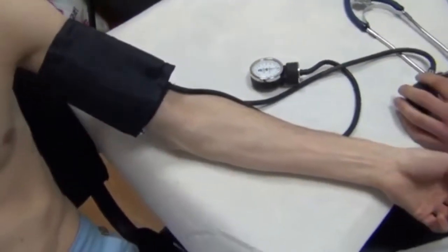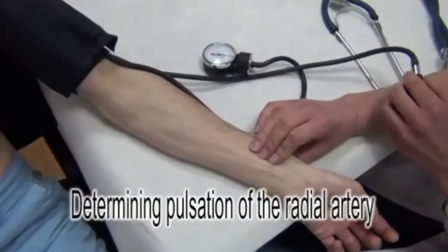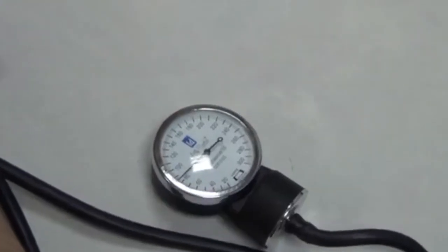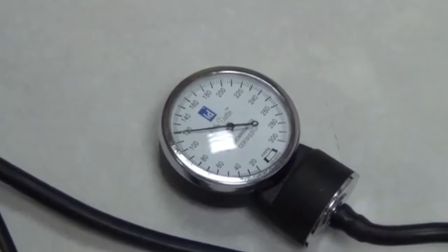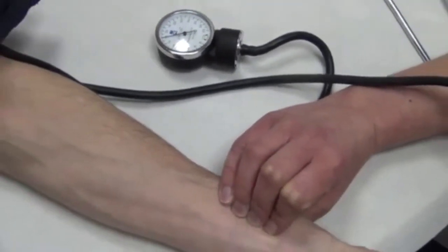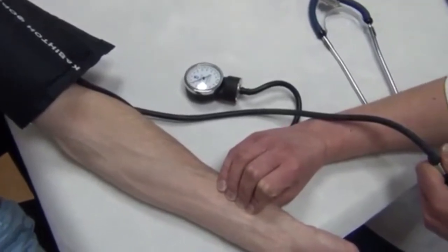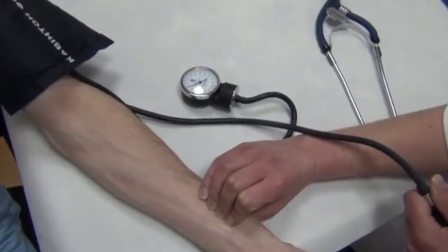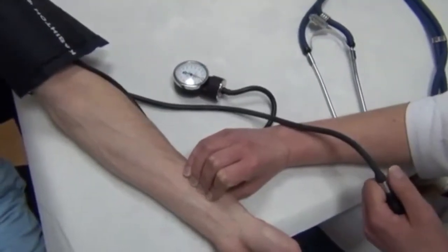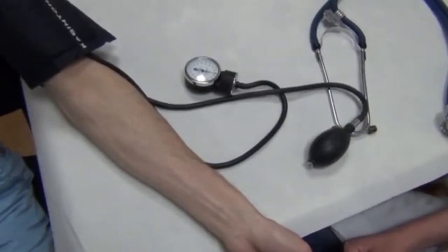In the case of primary BP measurement, it is recommended to first measure the systolic blood pressure using the palpation method. We find the place of pulsation of the radial artery. We inflate the air inside the cuff quickly up to 70-80 mmHg, then slowly in increments of 10 mmHg while feeling the pulsation of the radial artery. We determine the moment when the pulsation disappears, then insufflate an additional 10-20 mmHg and begin to deflate the air slowly. When the pulsation of the radial artery reappears, that is the systolic blood pressure value, which we will use for further identification of blood pressure level.